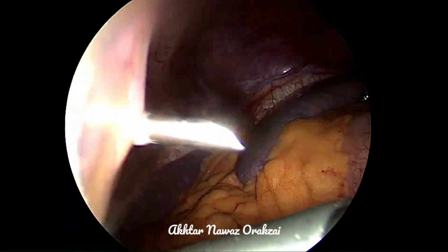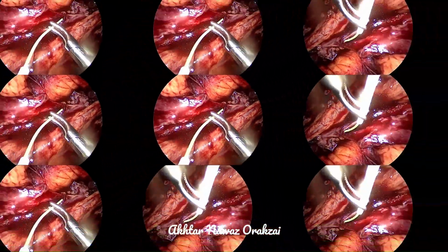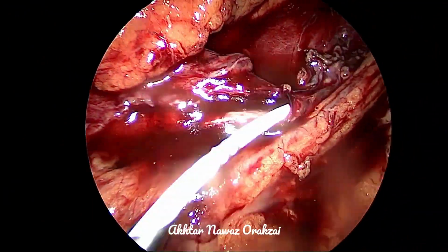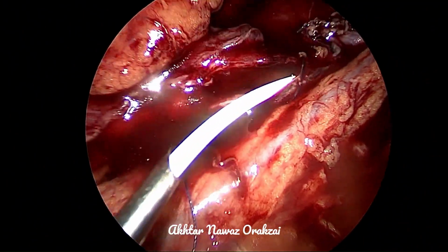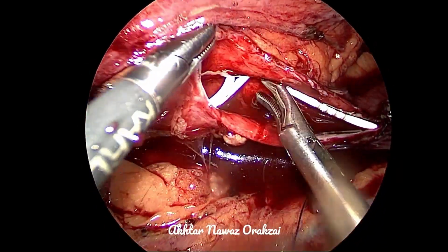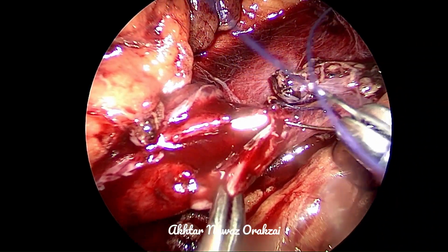So now we cut the tails of both the sutures, the previous one and this fresh one, because these tails may tease us. So we place a 2 millimeter alligator tip port so that it is in line with the ureter, and then we place the DJ stent, and we place this completely into the bladder so that the tip of the DJ is visible, and then you can very easily push the coil into the pelvic calyceal system, or better if you place the coil in the upper calyx.